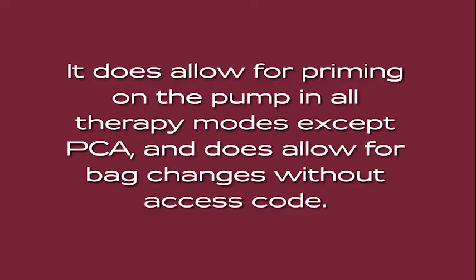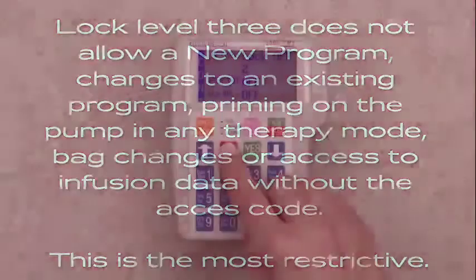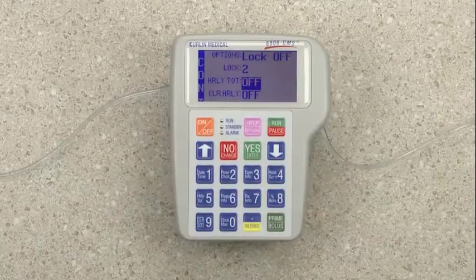Lock level 3 does not allow a new program, changes to an existing program, priming on the pump in any therapy mode, bag changes, or access to infusion data without the access code. This is the most restrictive. For this in-service, we will set a lock level 2.